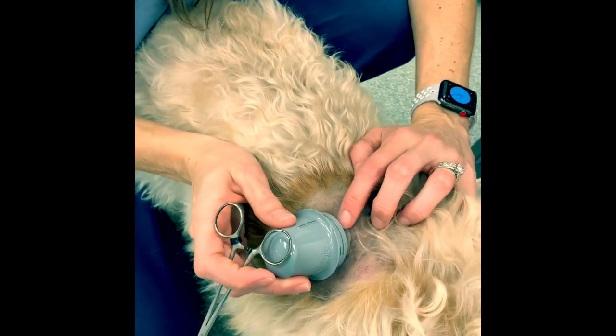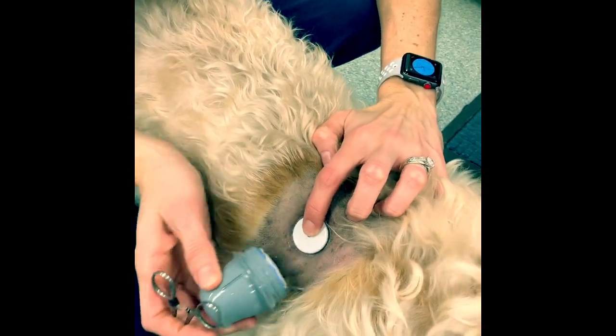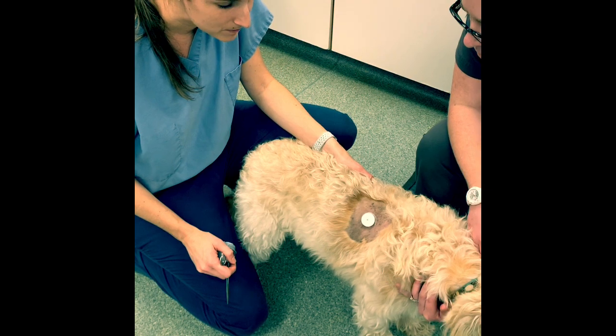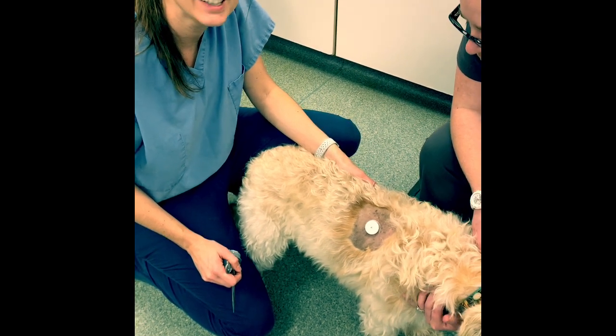There it is — it came out pretty nicely. There's Mick's little sensor. We're going to put a little t-shirt on him and then mom can use her iPhone to scan it and we'll get some great readings.